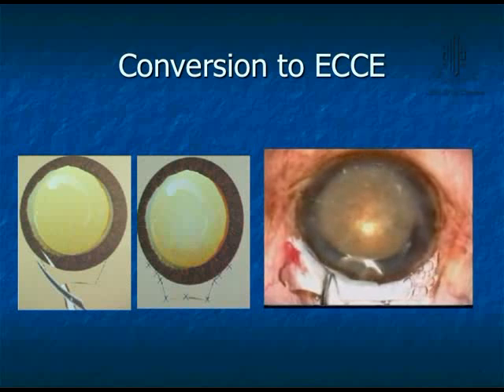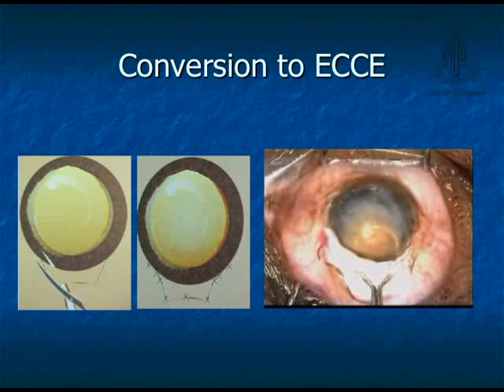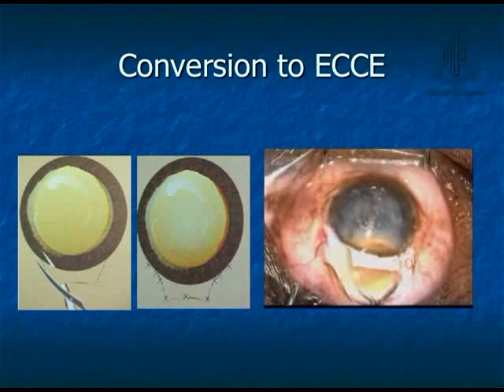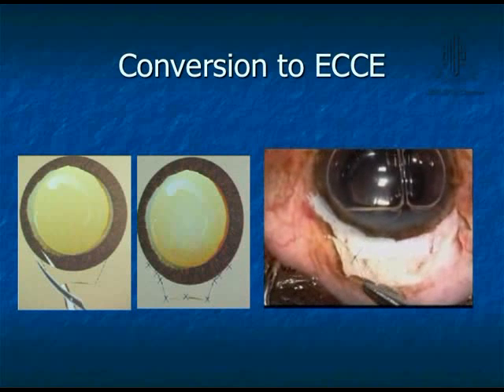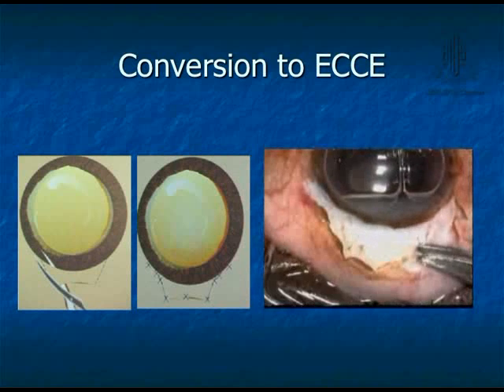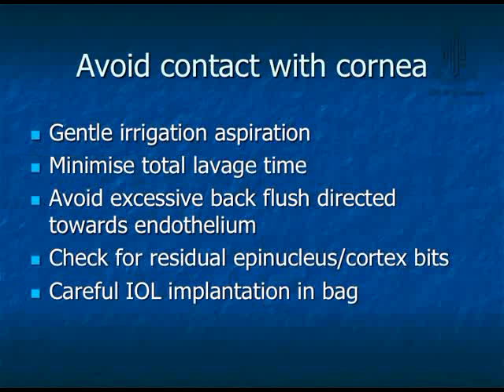And so after this has been done, then it becomes easy. You have to take the nucleus gently and take it out. Make sure that you put sutures in whatever possible areas. Especially the corner sutures are the more important ones, and then you can fill in with other sutures.